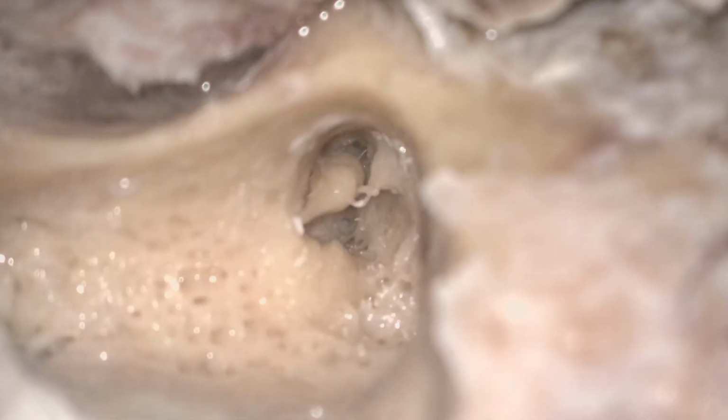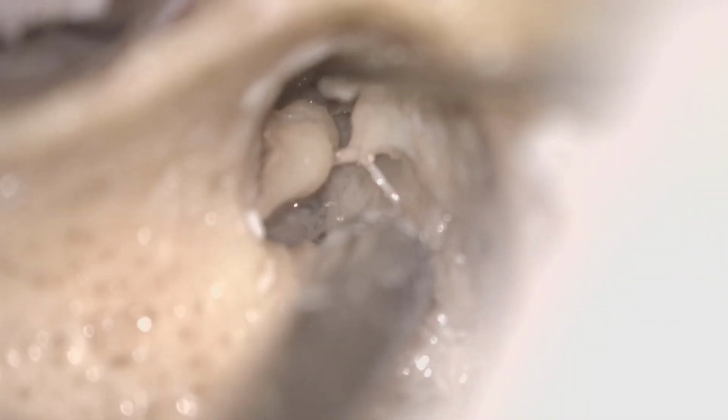So, this is the cog. Look at the structure. This is the malleus head and this bony structure that is coming from the tegmen, this is the cog. And here are the ossicles and the ossicular band that holds them.